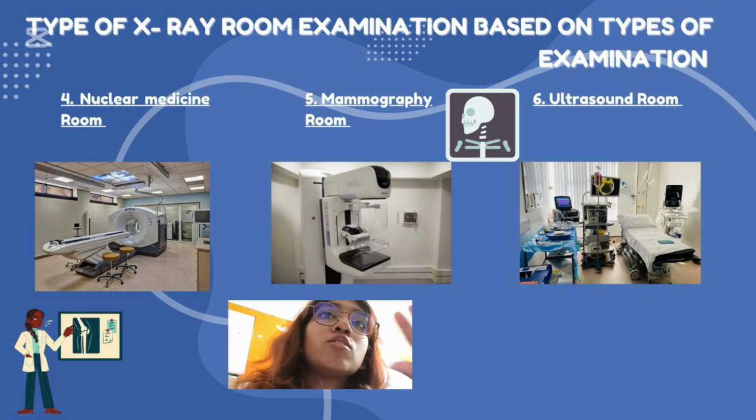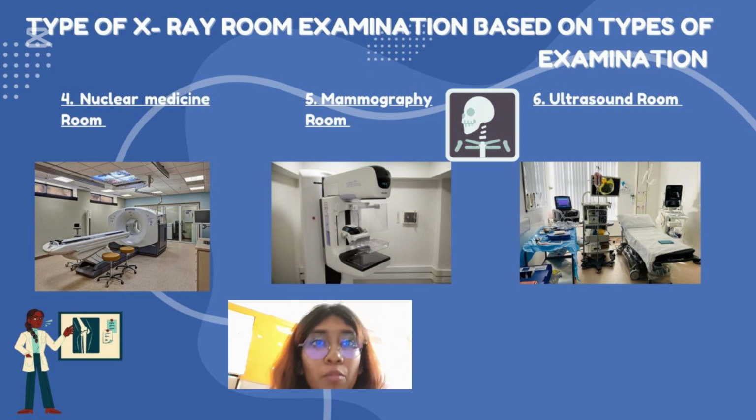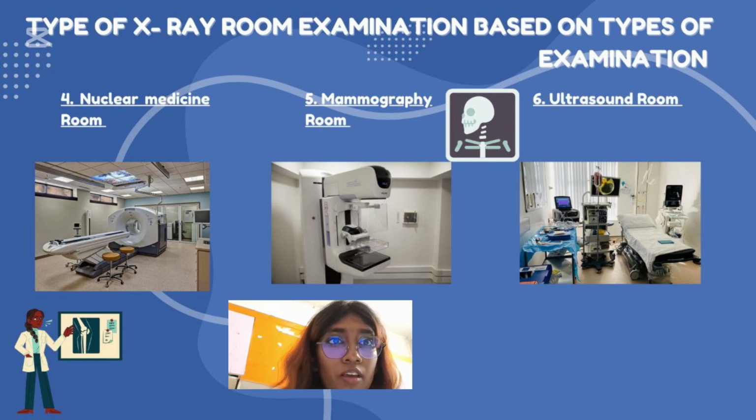So the fifth room is a mammography room. A mammography room is specialized for breast X-ray to examine for any early detections of breast cancer or any sorts of breast disease in the patient.